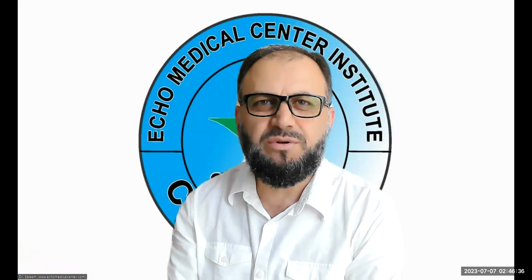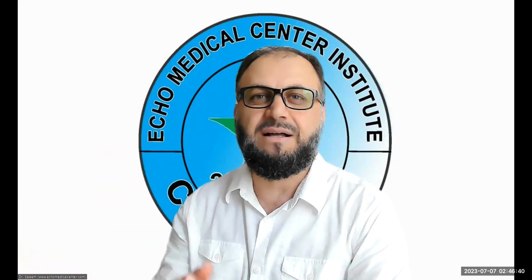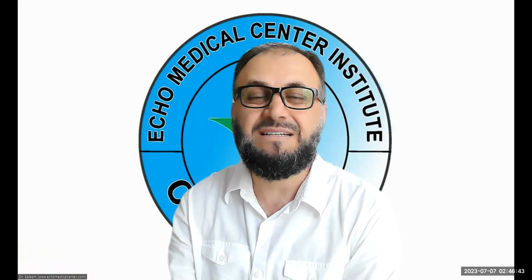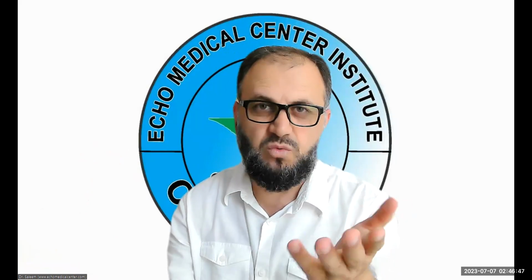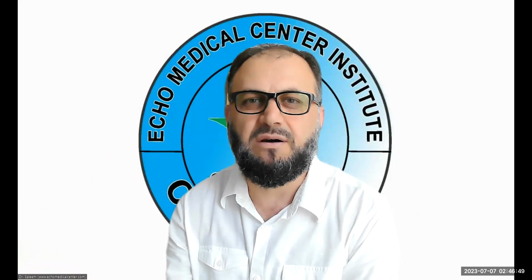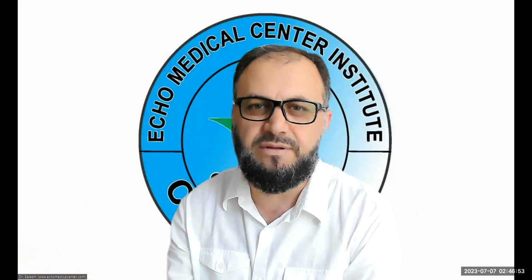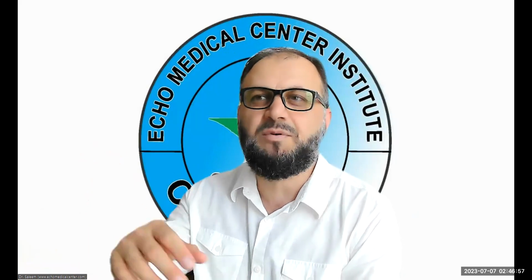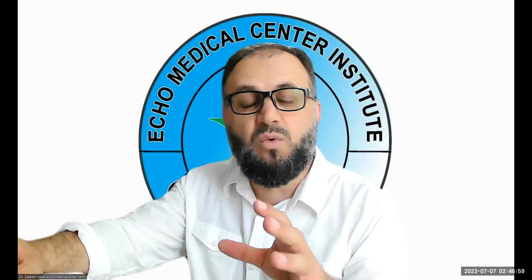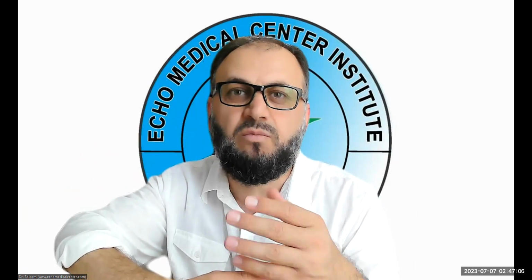I think it's a little important to talk about a few knobs from the knobology. So let's discuss a few knobs from the knobology which we use most commonly in our ultrasound department, specifically if it's a vascular Doppler, a general abdomen, small parts or anything. Let's talk about what their functions are and how we use them. Let's do this as a series of a few video clips.